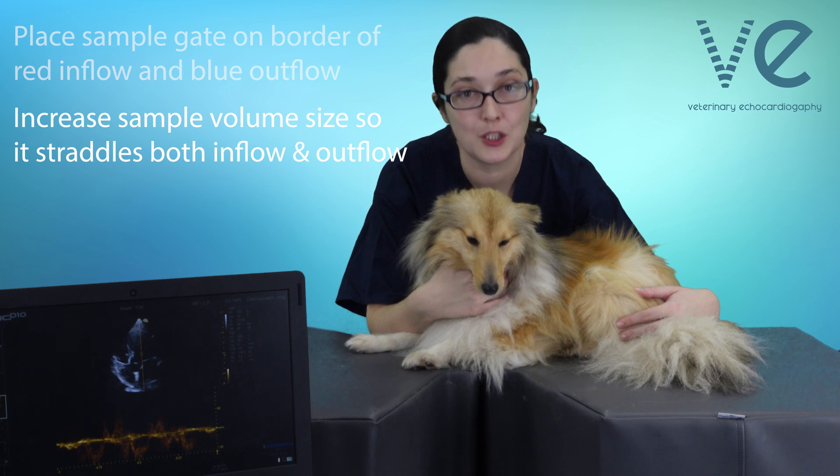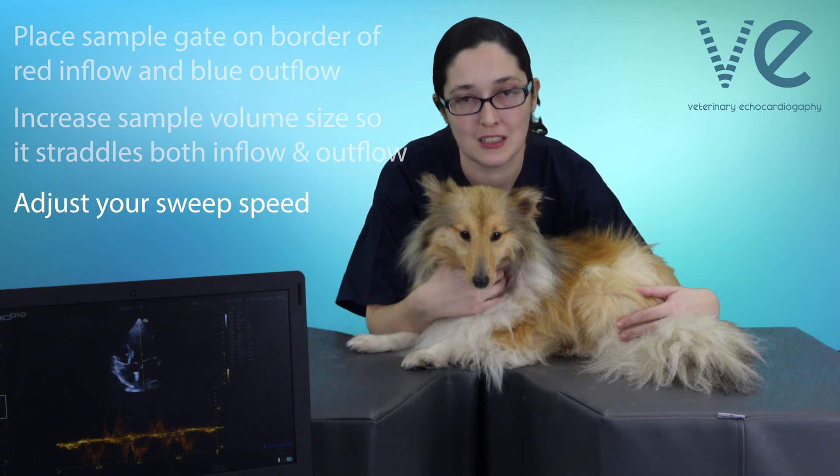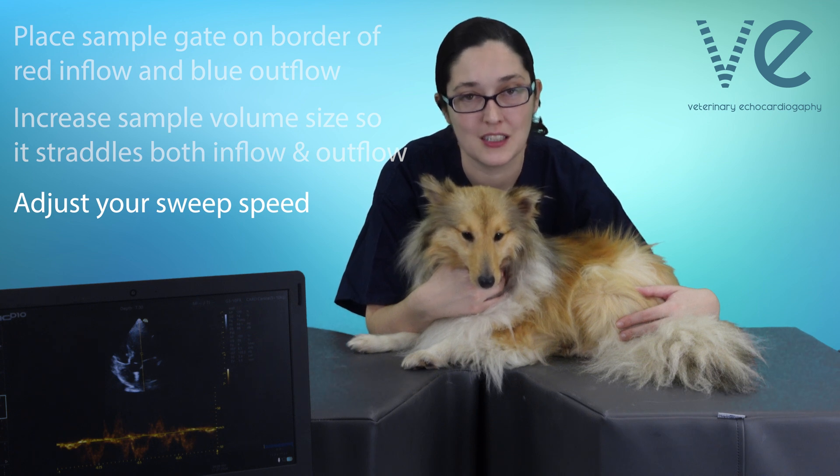Hopefully this is still giving you a good idea of where to place your sample gate and how to adjust it. Make it a little larger — it'll make your life easier. Make sure you change that sweep speed so you're getting just one or two sets of waveforms on your screen at a time; that's going to make visualisation and measurement so much easier. Bring your baseline a little bit up, just below the middle of your screen. And don't worry about catching the bottom of your aortic outflow or the tops of your mitral inflow — this isn't important from this view. You should only be using this trace for your IVRT.